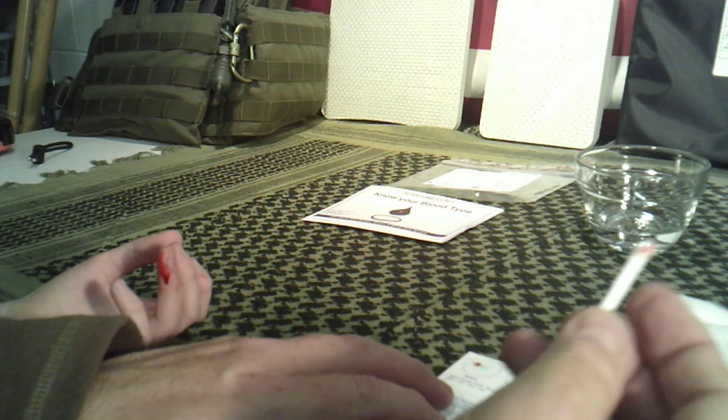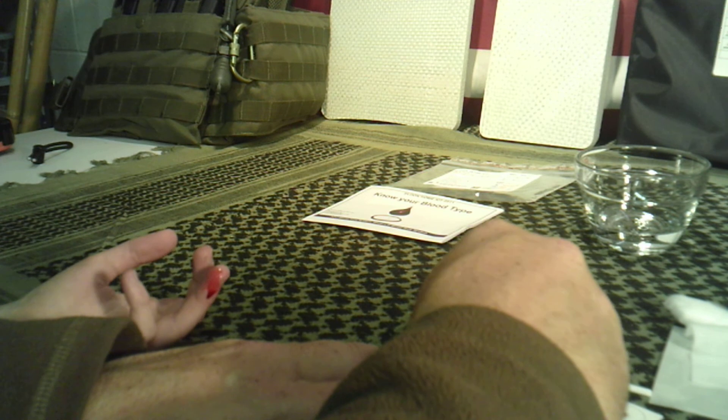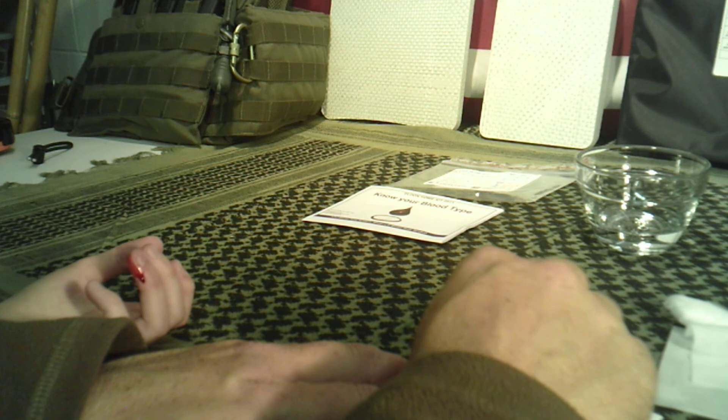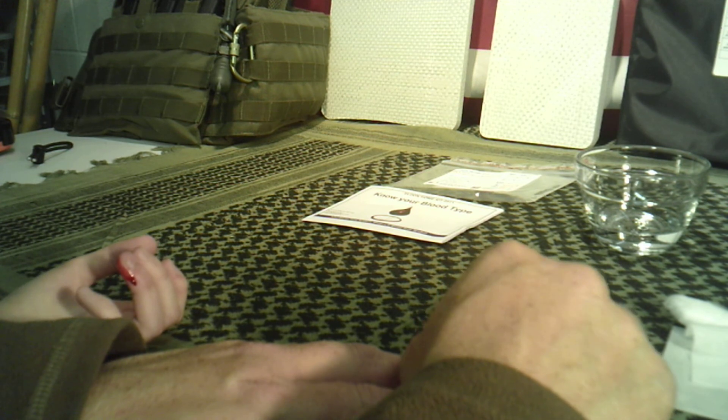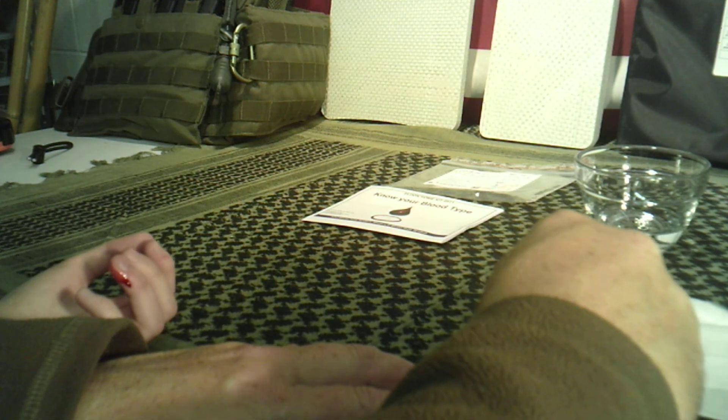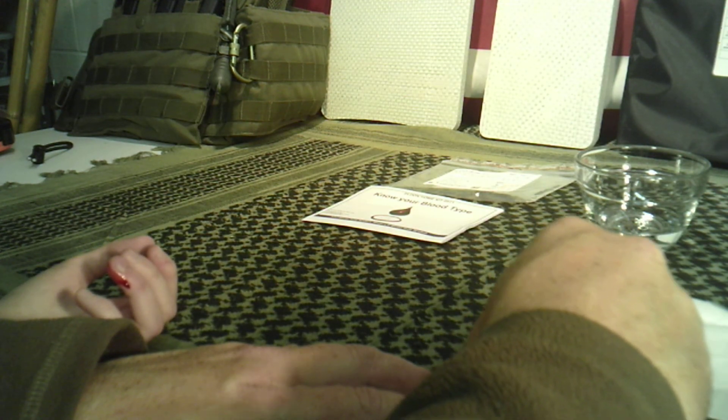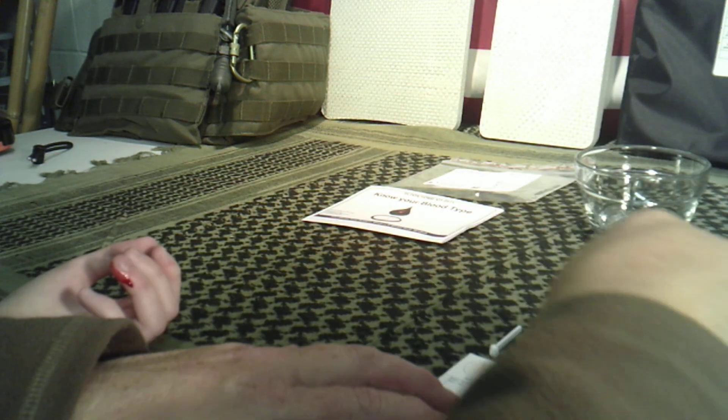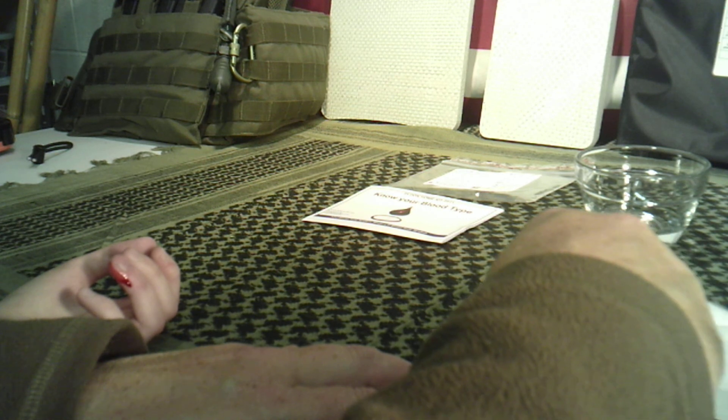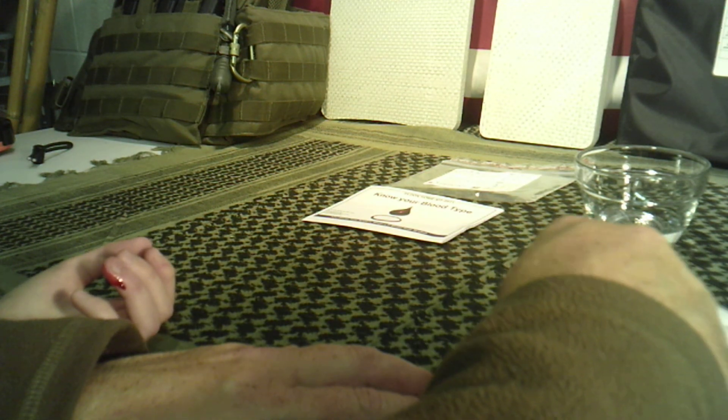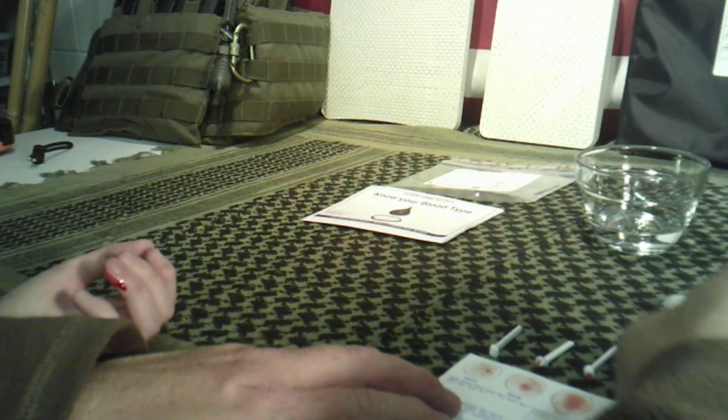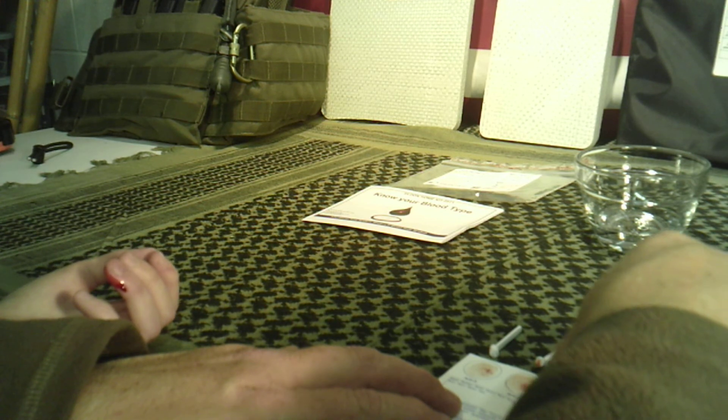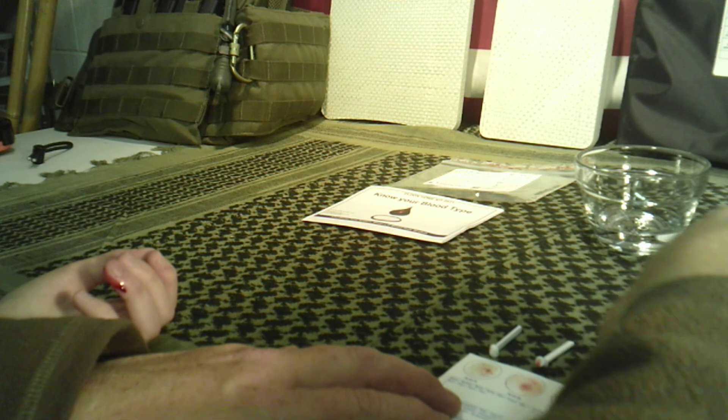Alright, so I've got them all. You'll take each one, make sure you're keeping them separate which ones you're using, and start spreading that around. Like that. Then take this one, spread it around. Like this. Take this one and spread it around, all around the whole circle. Take this one. That's why I keep up with where they're at.